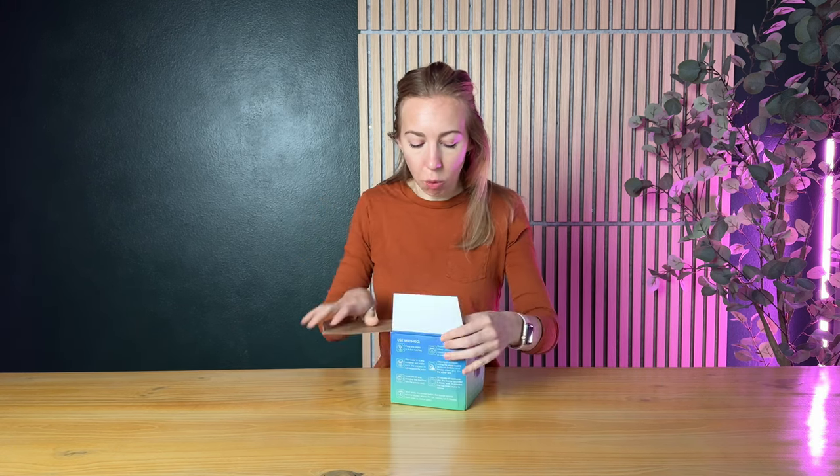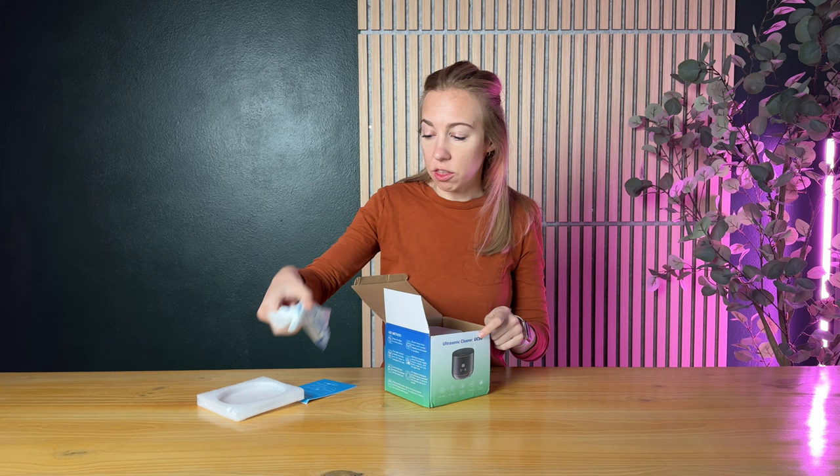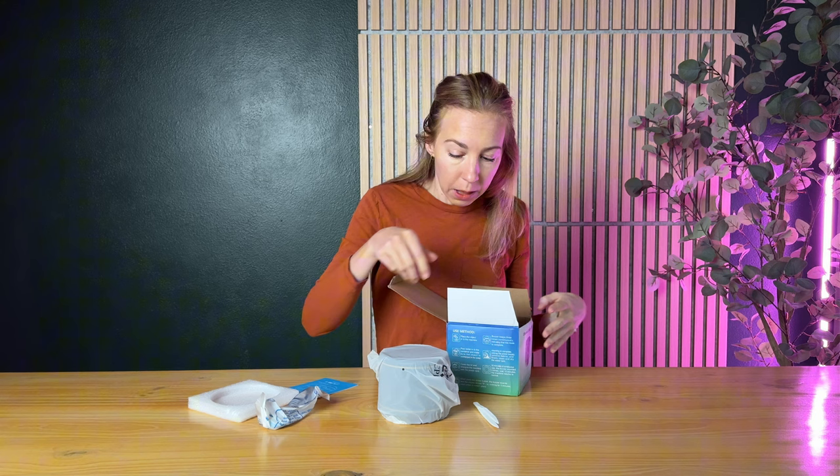I just got this new ultrasonic cleaner and let's go ahead and unbox it, then we'll try it out together for the first time. I'm really excited about this because it cleans so many different things. It can clean night guards, retainers, dentures, any of that kind of thing, but it also cleans other stuff like jewelry, baby pacifiers, watch bands, or any of that type of stuff that you need.